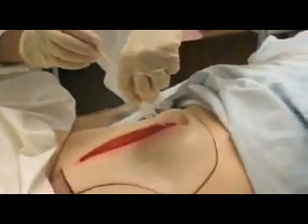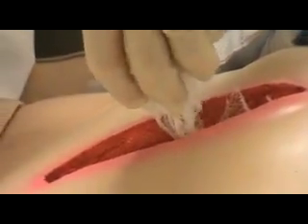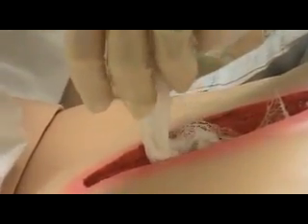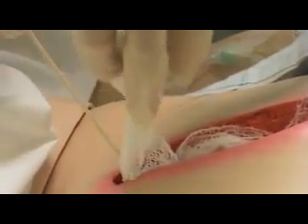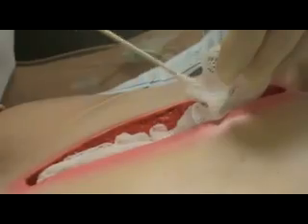I'm going to pick up my sterile cotton tip applicator. Okay. And I'm going to start. I'm going to zoom in a little bit if I can, so kind of maybe go exaggeratedly slow here. Very carefully put it in the wound. And again, you don't want to jam it in there. You've got to be careful not to touch the skin, because you don't want to get saline on the good skin, because that could also damage the good skin. Just like when you sit in the bathtub too long.